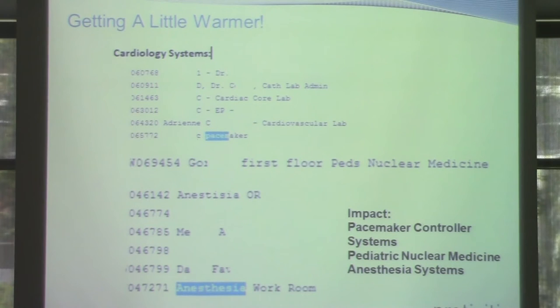So they took this and did all the analysis on this anesthesia cart, and it was something you couldn't prevent. It had to be a specific iPhone model with a specific version of iOS. If they plugged in Android phones or other iPhone devices and iOS levels, it didn't affect it. They plugged this one in and it just dumped it.